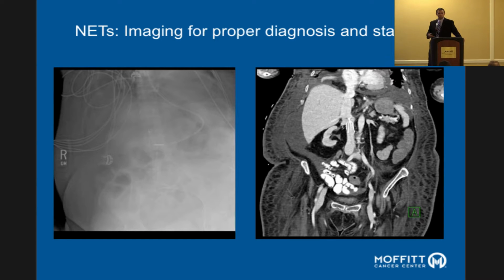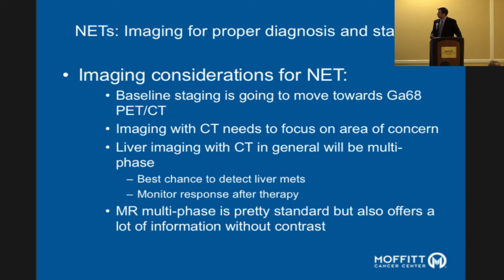Many times you find patients don't have appendicitis. So an operation would have been of no benefit, and it could have harmed you because you had another process going on besides appendicitis, but now you've got a big slice in your abdomen. So there are multiple studies, in emergency medicine, trauma imaging, all these things, about why we're switching to CT scans. But this does result in a radiation dose to our population. I'm going to address that right after this.